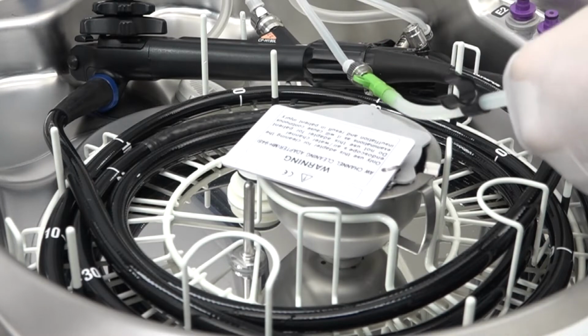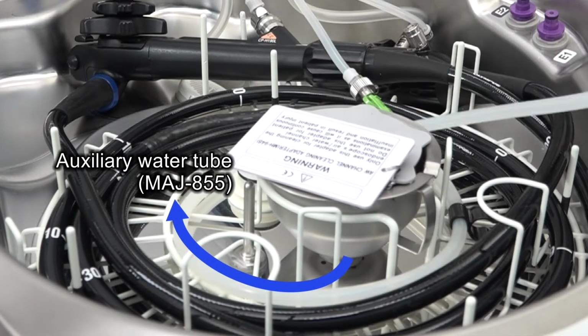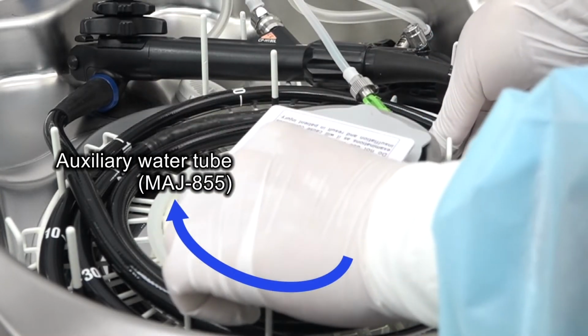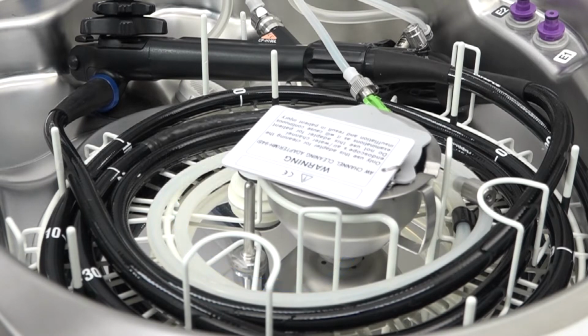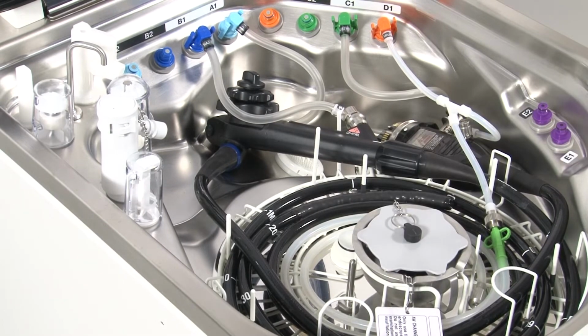Wrap the auxiliary water tube clockwise in the inner area from the universal cord. After setting the auxiliary water tube, place the plate in the original position.